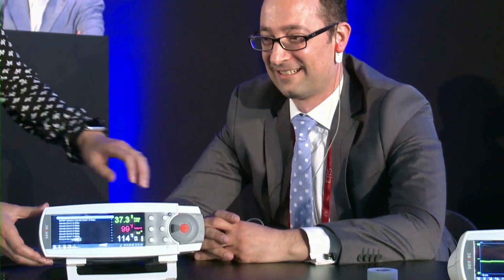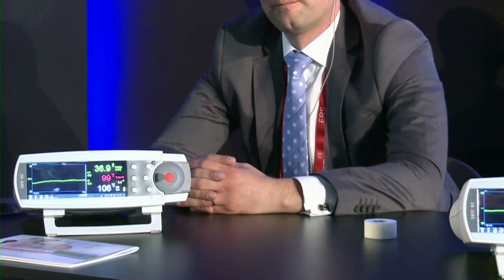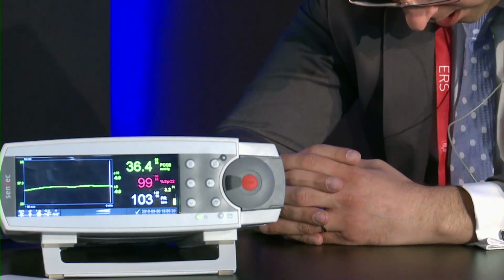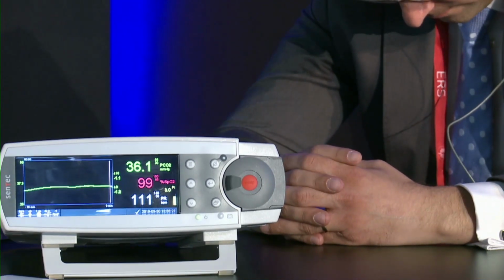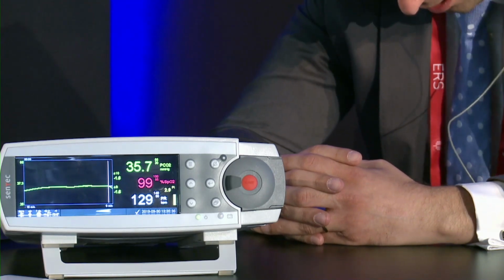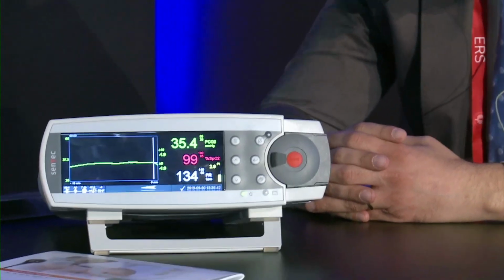The reference point is called a baseline at SenTec. Why is a reference point needed? It just shows what the difference is. Could you zoom in more on the monitor, please? Here, you can see the white line. We will have a horizontal and a vertical white line there, which shows what the reference point was. We could have the reference point for 10 minutes, half an hour, or even longer. It just shows what the change is. Basically, if we adapt the ventilator settings, we can then see 24 hours later what my change was. Did that work or not? Okay.